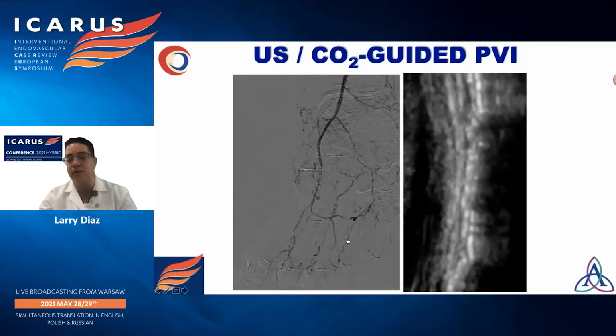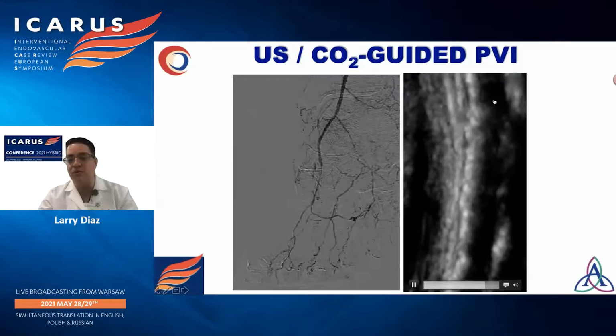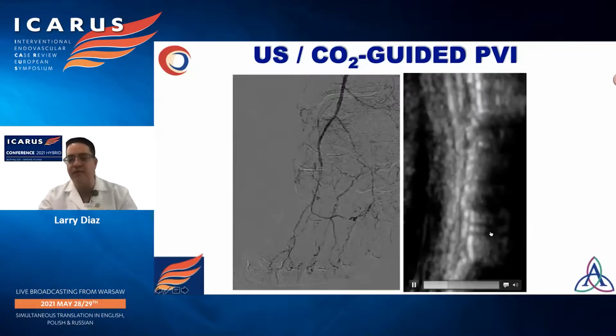Here's the final picture with the ultrasound on CO2. And this is the CO2 bubbles passing through the lumen of the patent dorsalis pedis.